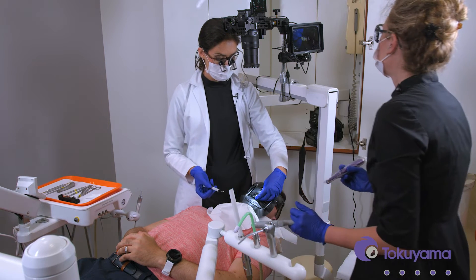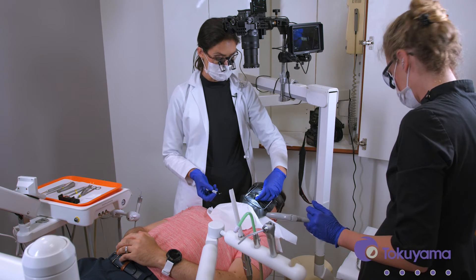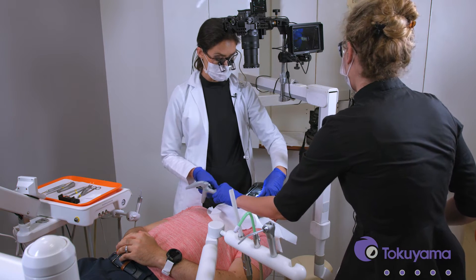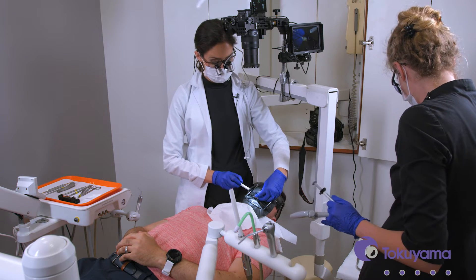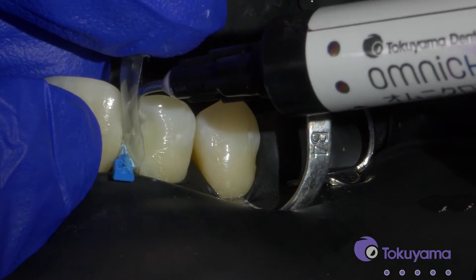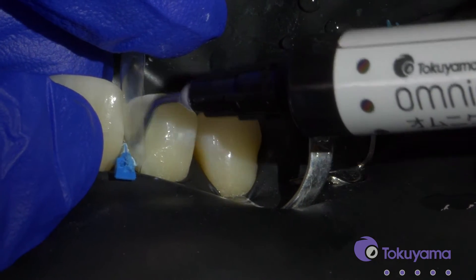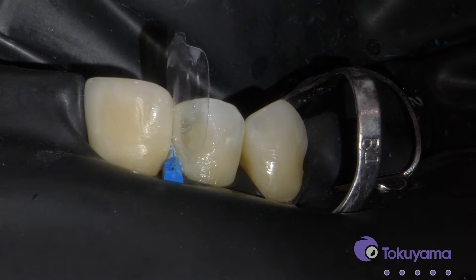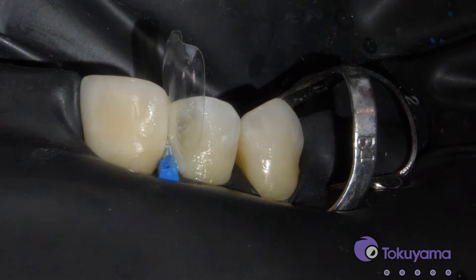For the anterior tooth, we're going to need to use both Omni-Chroma and Omni-Chroma Blocker, because if we don't use the blocker, we're going to get a lot of translucency, so we want to match that. So I'm going to just build the enamel part — just that contact first with the regular Omni-Chroma — and then I'll apply the blocker just where I expect the dentin to be. When it goes on it's really white, but don't worry.